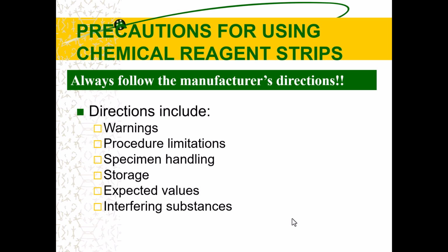So it's always important, if anything changes, if they've updated anything, a new kit, you might have kit A, and now you're at kit B, read through your procedures, read its limitations, read all of that. Same thing with urine strips. If you get an updated urine strip, a different brand, whatever, read through the inserts. Anytime this happens.